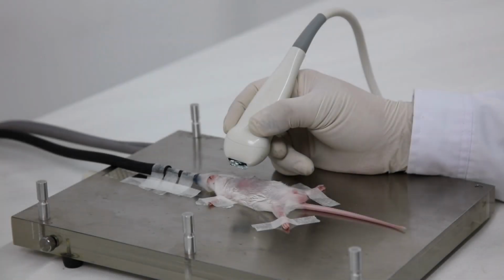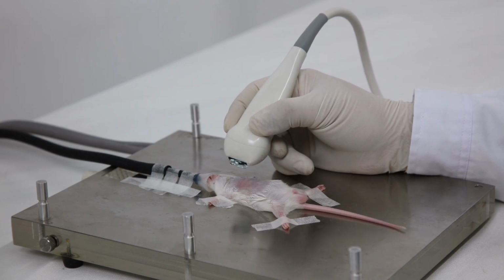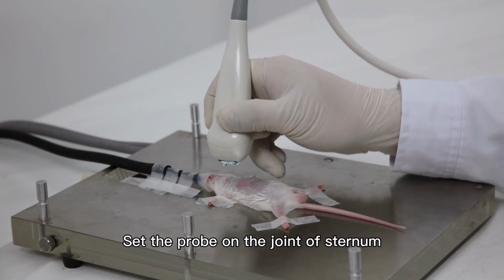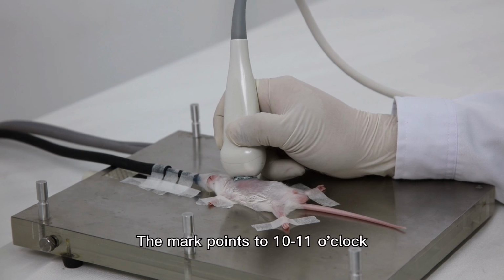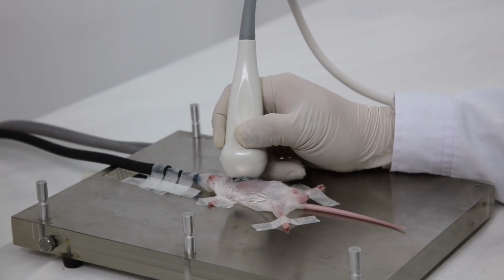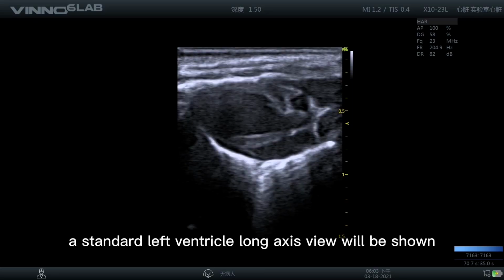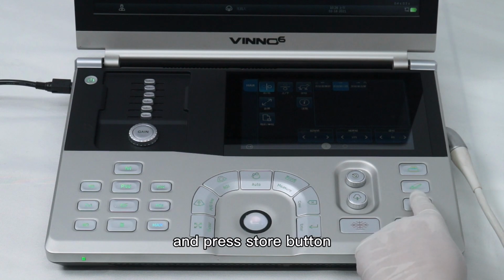Long axis view of the parasternum. This is one of the most important views to evaluate systolic function of the left ventricle. Set the probe on the joint of the sternum and left costal cartilage vertically. The mark points to 10 to 11 o'clock. Adjust the probe slightly. A standard left ventricle long axis view will be shown. And press the store button.